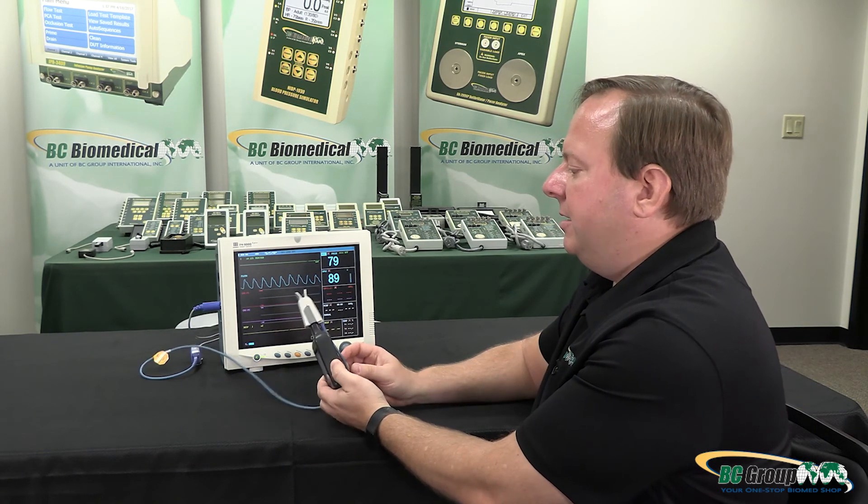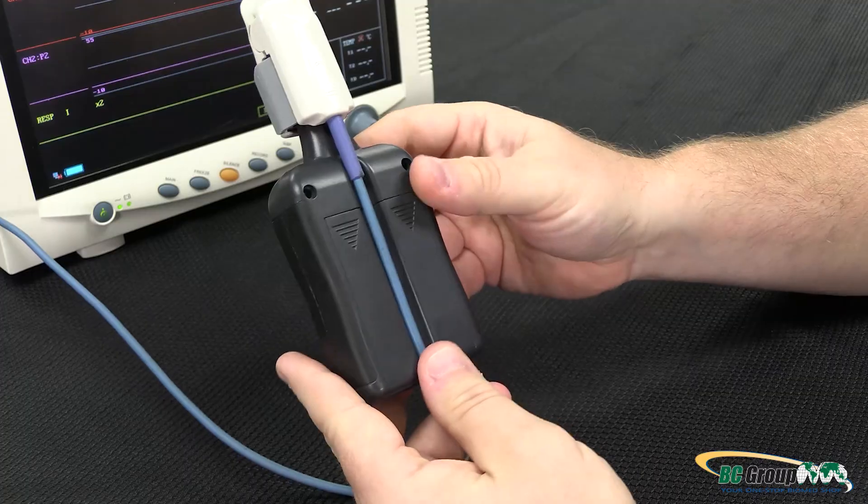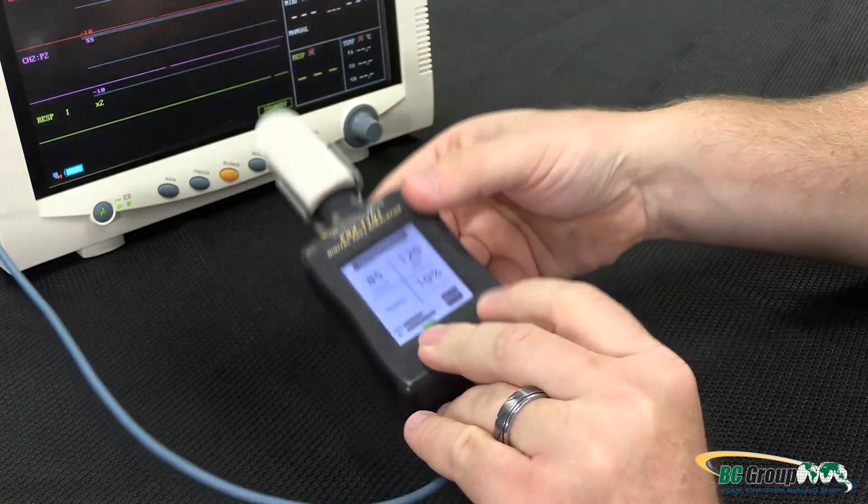Those are the main features of the FSX 1101. We do have a cord guide in the back to hold the cord so we can lay this flat and it will sit flat on the table. That concludes all of the basic features and functions of the FSX 1101 SpO2 simulator. For other training videos or more information about BC Group products, please visit us on the web at bcgroupstore.com.